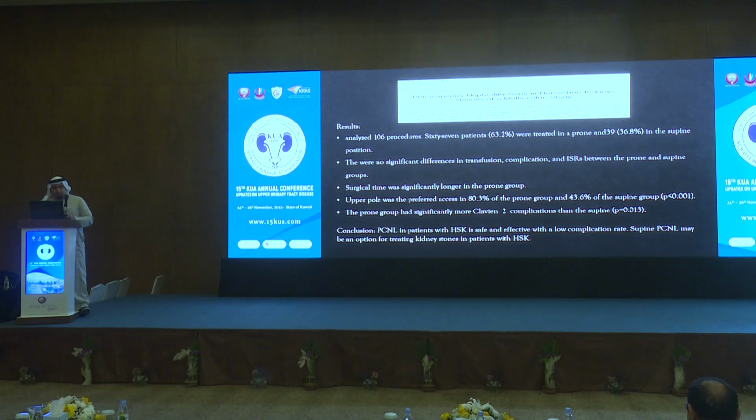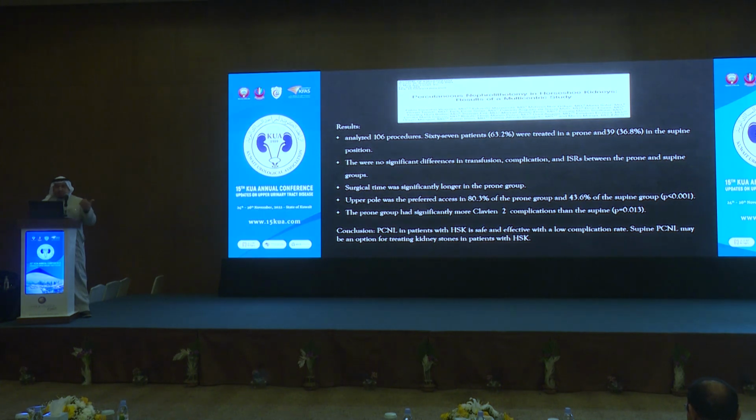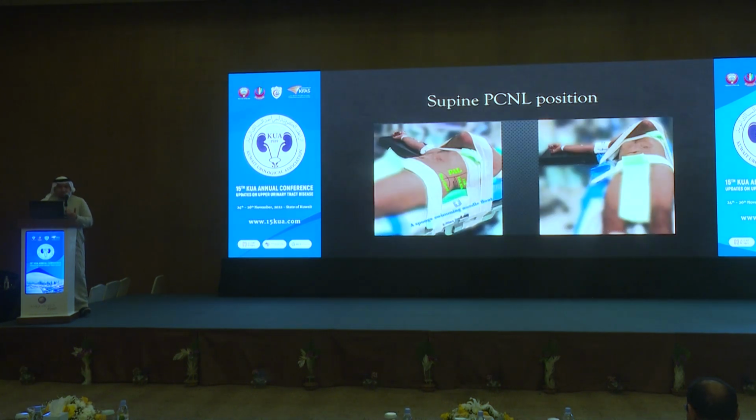Upper pole access was preferred in 80% in the prone position, while in supine position they actually preferred the lower pole more than the upper pole. This is the way I do it: I put the patient supine and just elevate the patient 15 degrees.